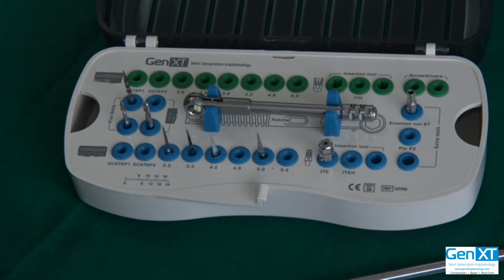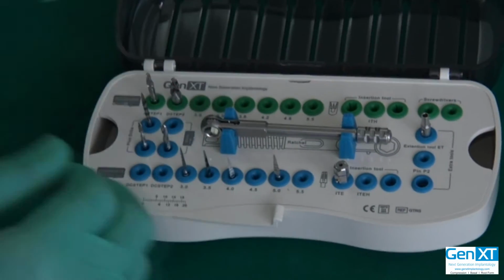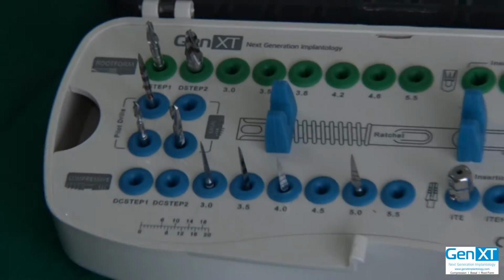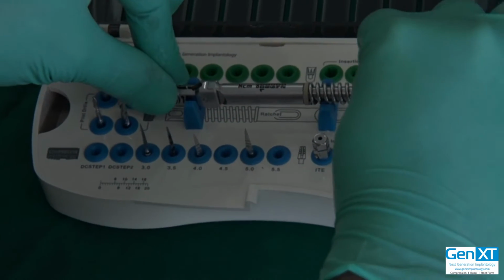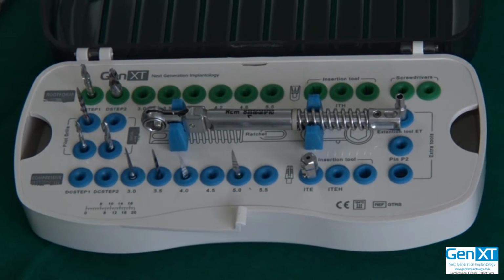Basically only 2 additional drills that when you buy, they will go into the slot here of step 1 and step 2. Additionally, it is advisable in the 2-piece to get rid of the basic ratchet and to get the torque ratchet, because you need to tighten the abutment screws and you need to check the insertion torque on the 2-piece, not let it exceed 45.